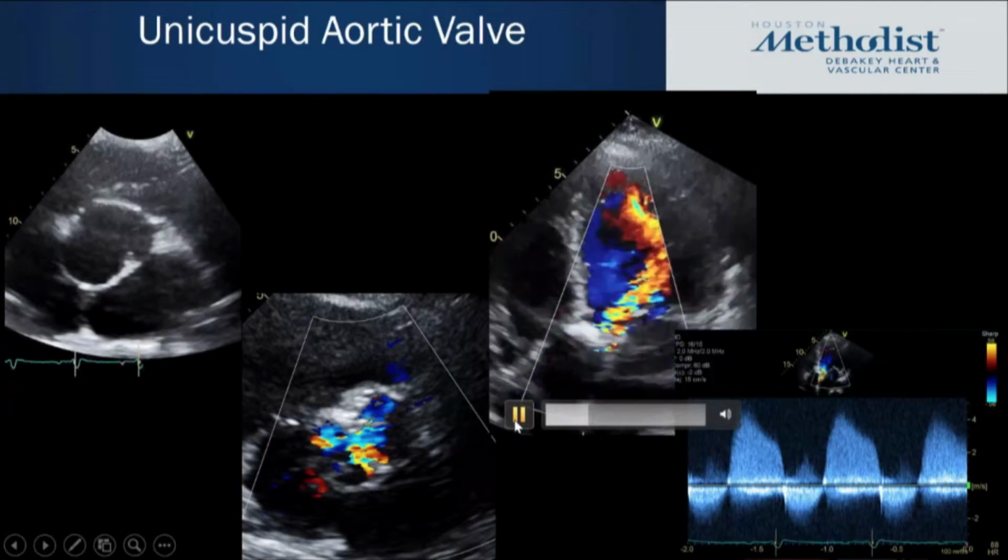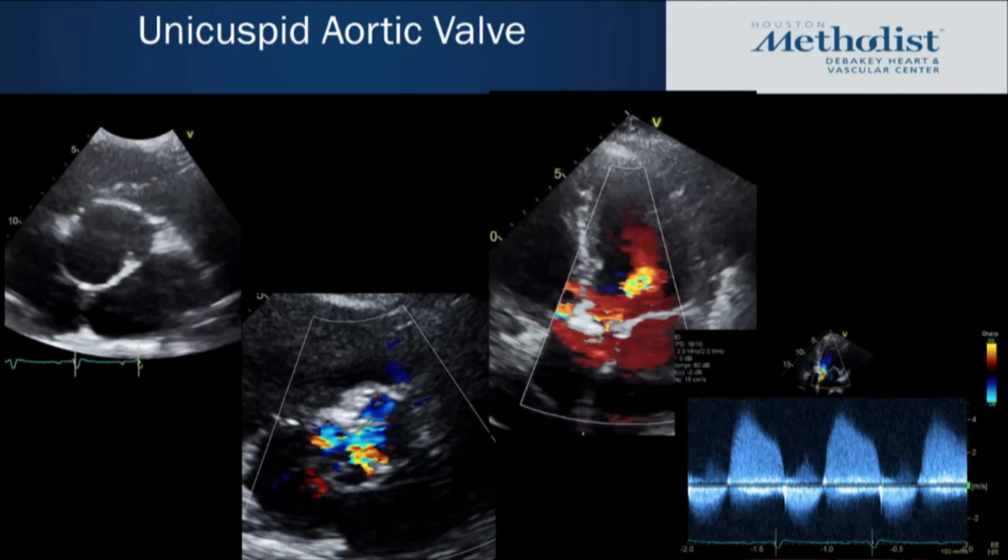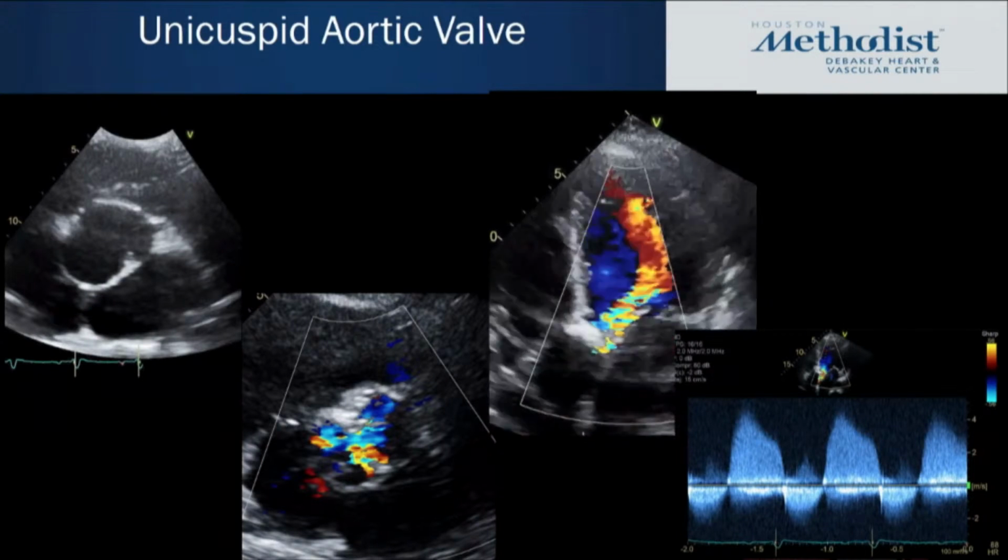And this is your parasternal, your apical view showing that eccentric aortic regurgitant jet. Again, a CW through the jet. You can appreciate that the backflow, the diastolic jet, is as dense as the forward flow jet, which speaks of the severity of this lesion. The patient again was referred for surgery and underwent aortic valve replacement. So again, evaluate for the mechanism, severity, and consequences, because that can guide management.